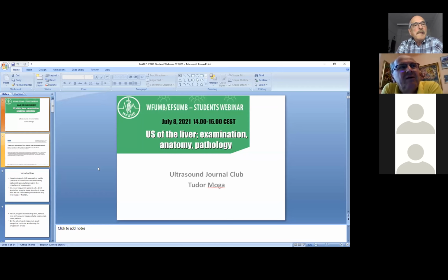Okay. For us with long experience, usually I try to transform this large amount of ascites into a number of liters, 10, 15, but it's speculative. Probably it's more correct to say mild or minimal. Usually I say minimal ascites, mild ascites, moderate ascites, and severe ascites, looking in all the pouches: the Douglas pouch, the perisplenic region. Okay.